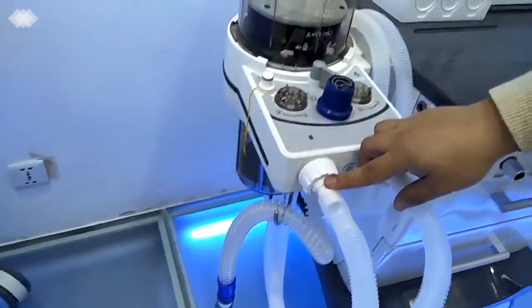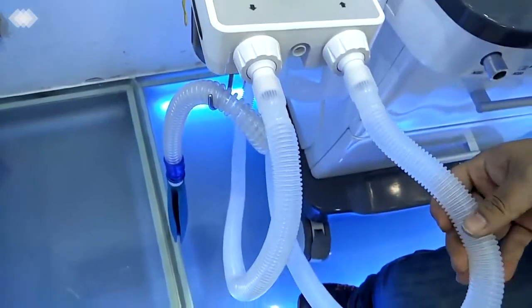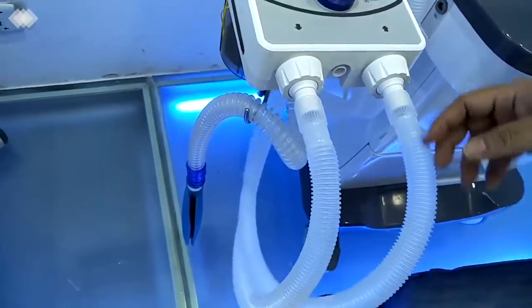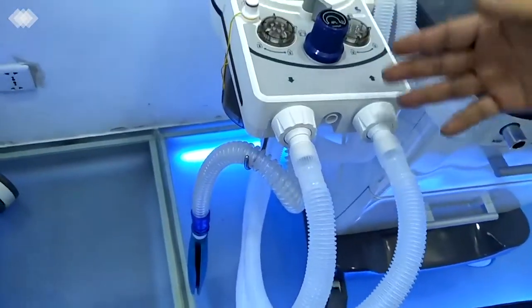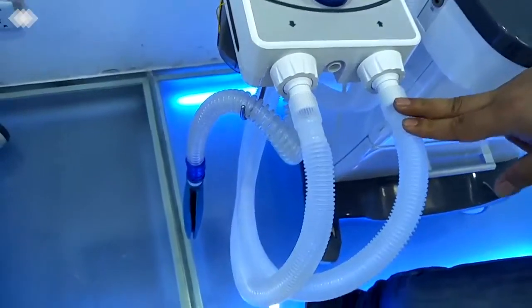And here is the inspiration port and expiration port. The pipelines we are using are all reusable ones. You can use them for at least 1 to 2 months for different patients, and they can be cleaned at 134 degrees and are autoclavable.